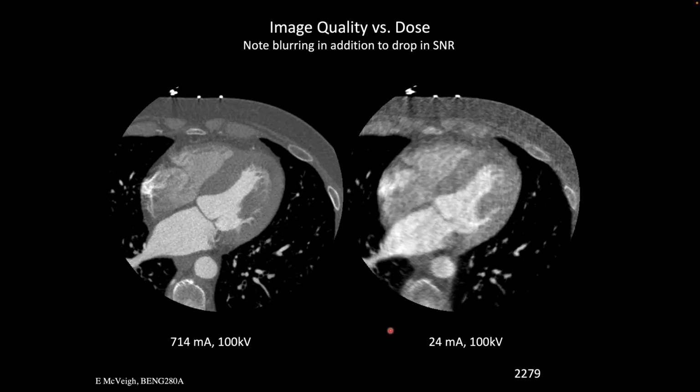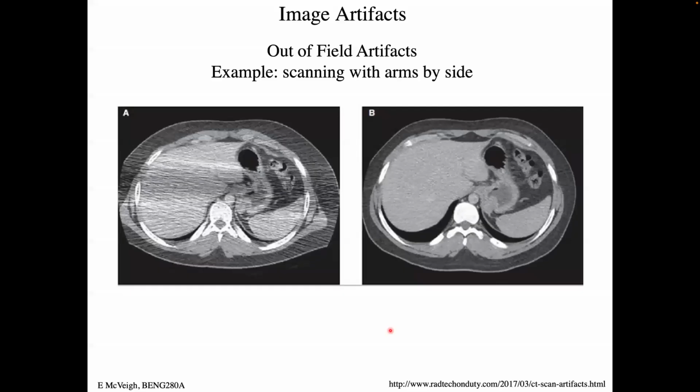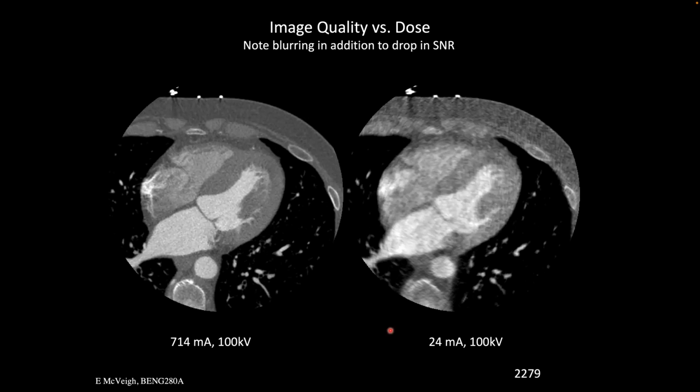There's a function that just says save raw data, and I'll do it. It was mostly for subsequent reconstructions. If you want to save it, because this time next year they're going to have a recon algorithm that's way better. So we've saved raw data for a long time, and we have taken it back to the scanner and used their new deep learning reconstruction on that raw data and produced much better pictures, right? From years ago, right? They were collected years ago.